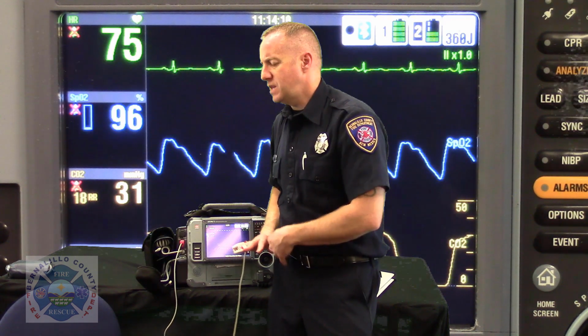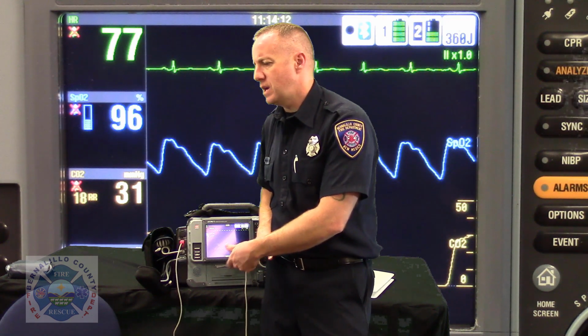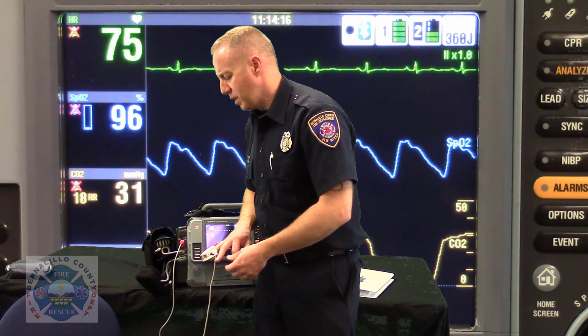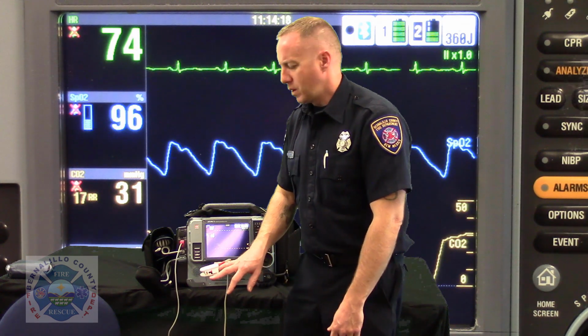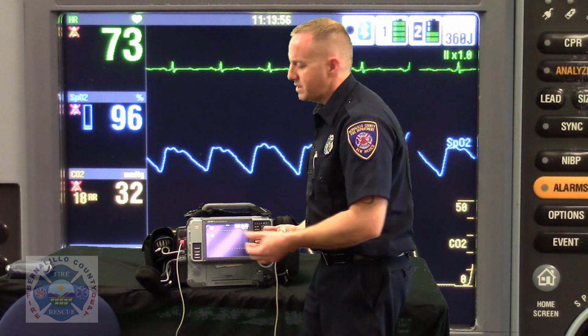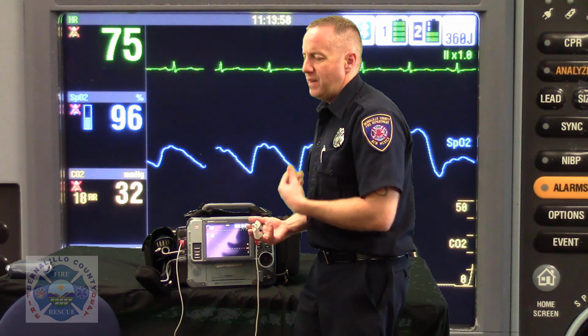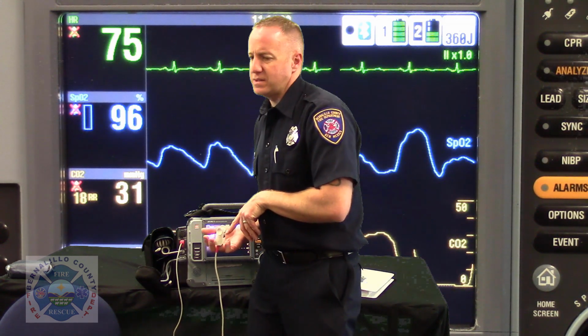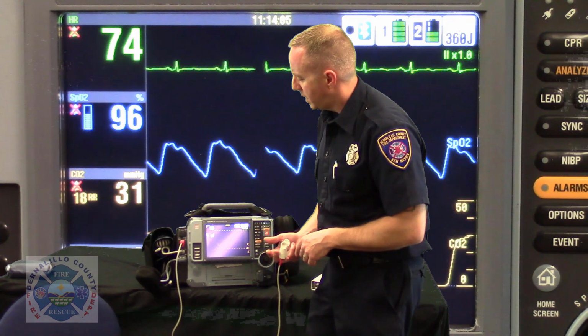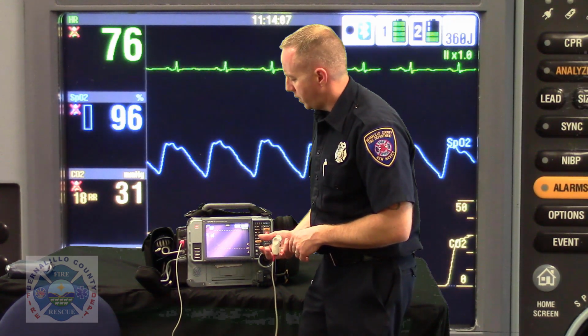So, if the patient's seated and you can maybe pull their t-shirt over it, or maybe there's a towel or something nearby you can cover that up with, then you want to go ahead and do that. Now you'll notice that it takes the monitor about 30 seconds to calibrate that it sees what it's wanting to see through the infrared light, and it starts displaying a reading for you.